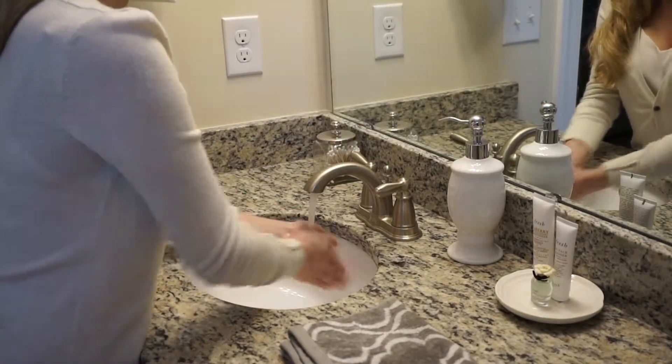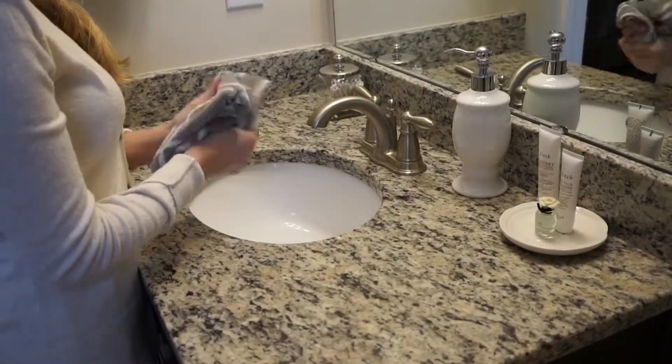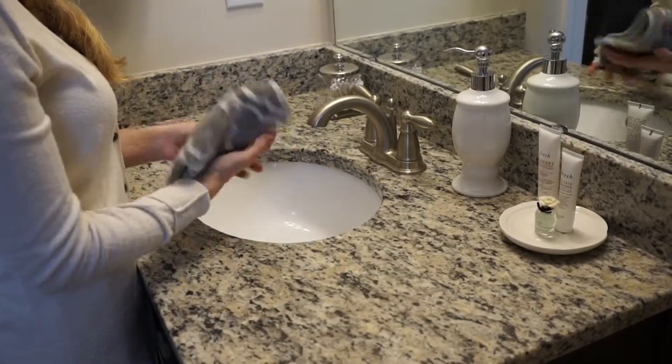Step 1: Thoroughly wash your hands with soap and water. Step 2: Dry your hands with a clean towel.